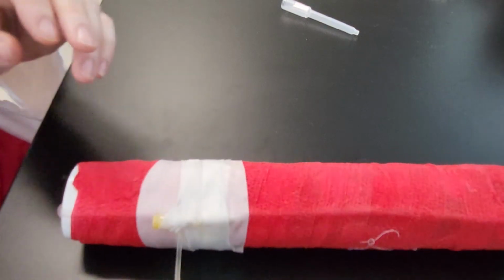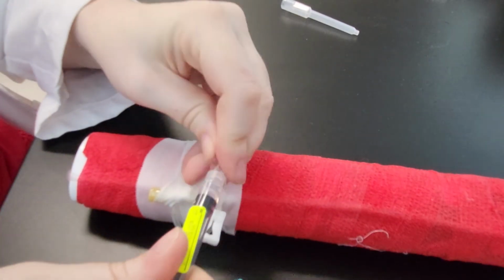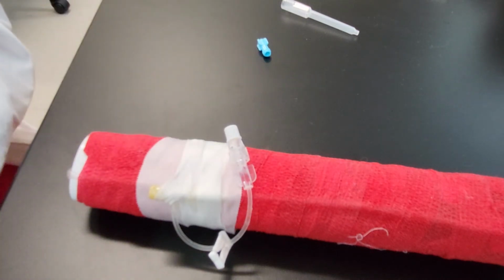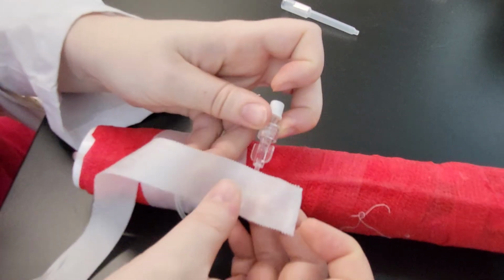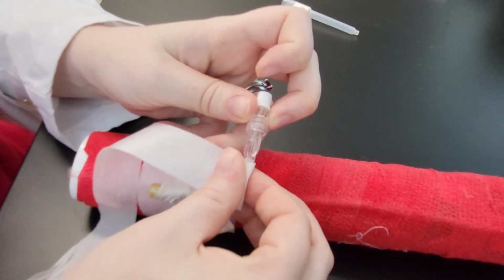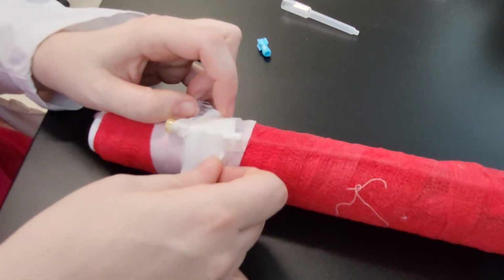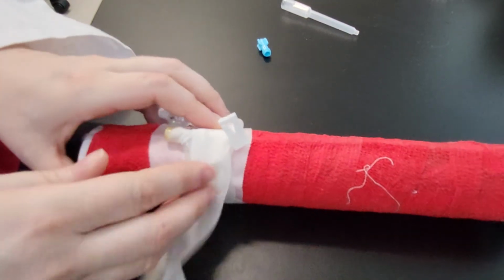Now this is your very last part, securing the portion of the T-port onto the leg itself. I am going to place my male adapter port on the end of my T-port. I'm going to take my very last piece of tape. I'm going to place the tape sticky side down around this portion of the extension set on the T-port. So once I've done that, it's gonna curl naturally, and so I'm gonna just follow the natural curve of the extension set here on this T-port, and I will tape it down like so.